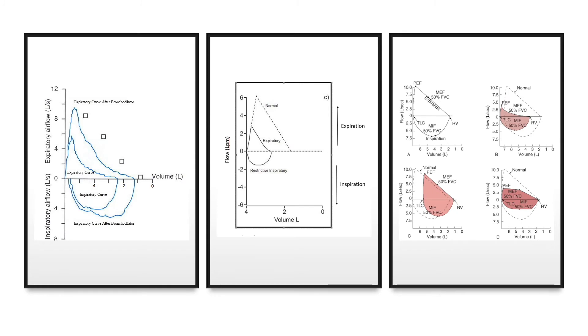So with that understanding of how spirometry is performed, you may encounter the display of the spirometry in flow volume loop graphs in different formats. In all flow volume loops, it is consistent that the x-axis represents volume, the y-axis represents airflow, down is the inspiratory limb of breathing, and up is the expiratory limb of the flow volume loop.